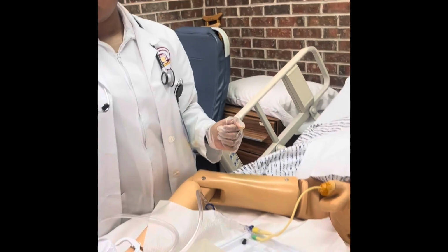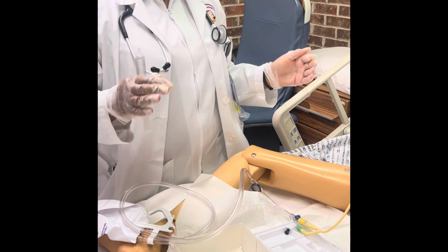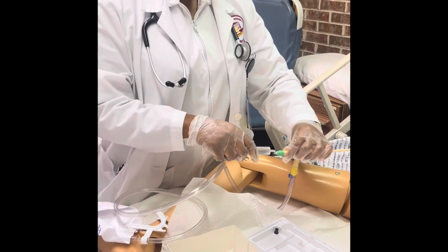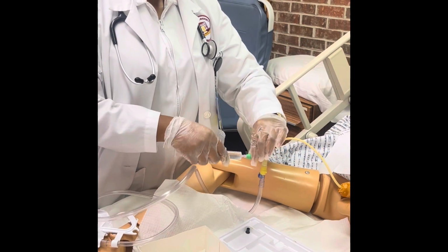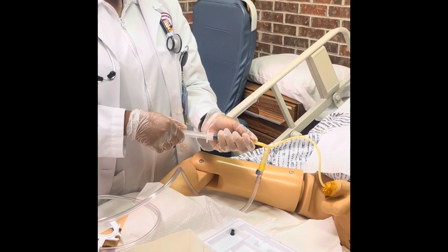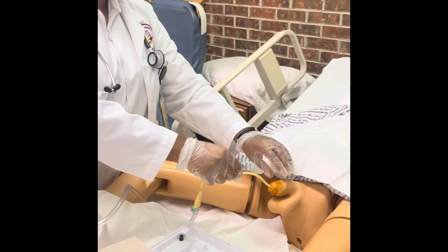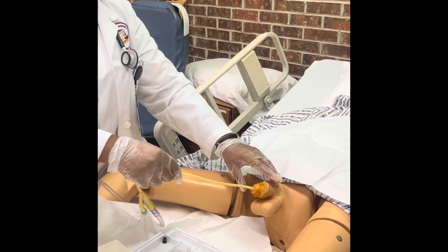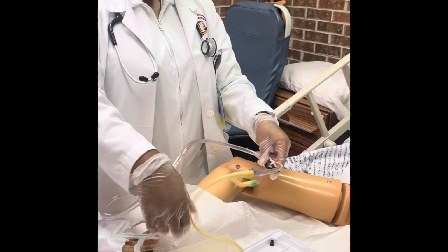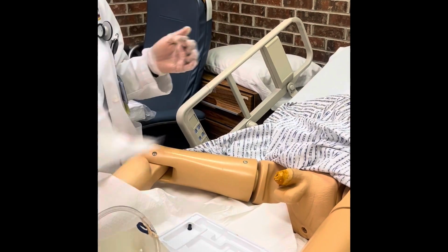To discontinue a urinary catheter, we want to grab the syringe. After doing hand hygiene, put on gloves, grab the syringe, apply it back to the catheter, and pull all of the saline solution out so you can deflate the bubble. All right, Mr. Smith, now I'm going to pull the catheter out, take a deep breath. All right, then clean up and get him back in a comfortable position and lower the bed.